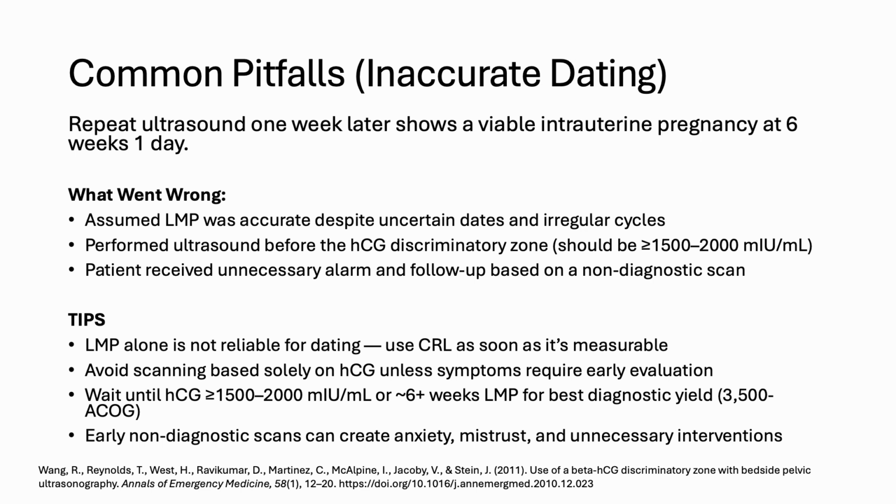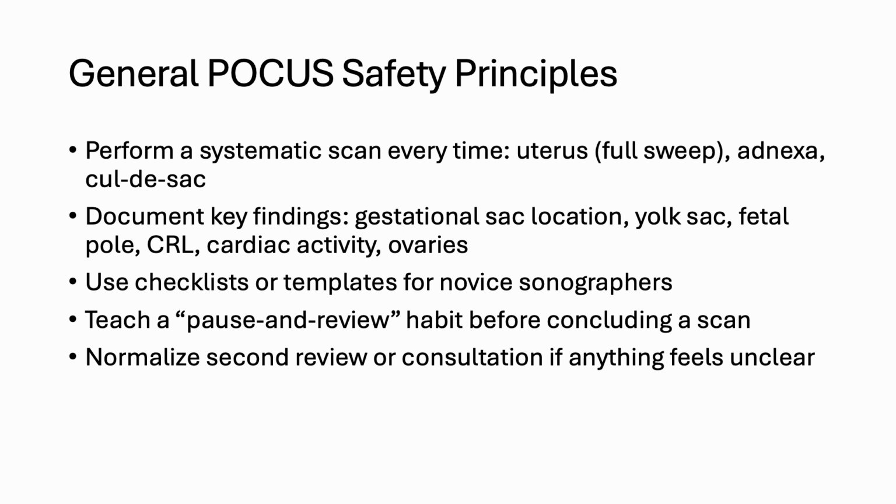I do like having an early dating ultrasound, but not too early. So you want to make sure that you correlate it clinically, and you can read more information on this in this article.